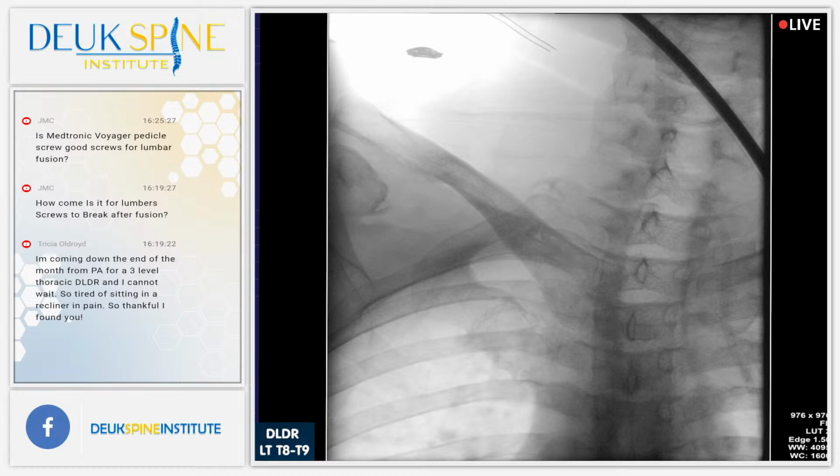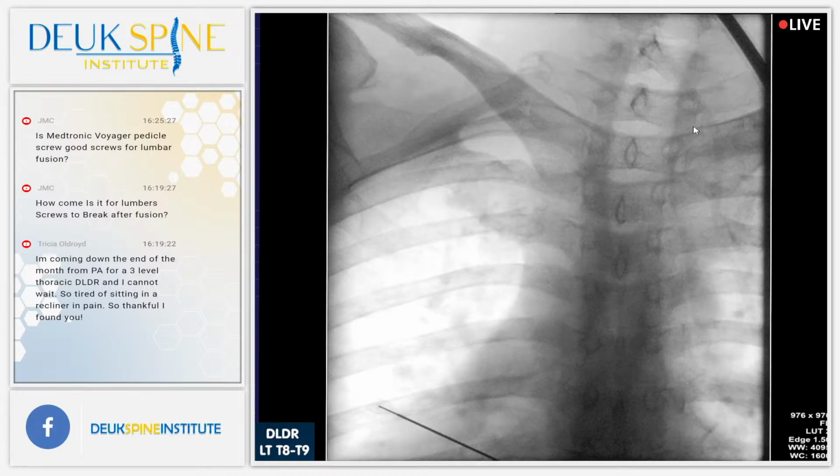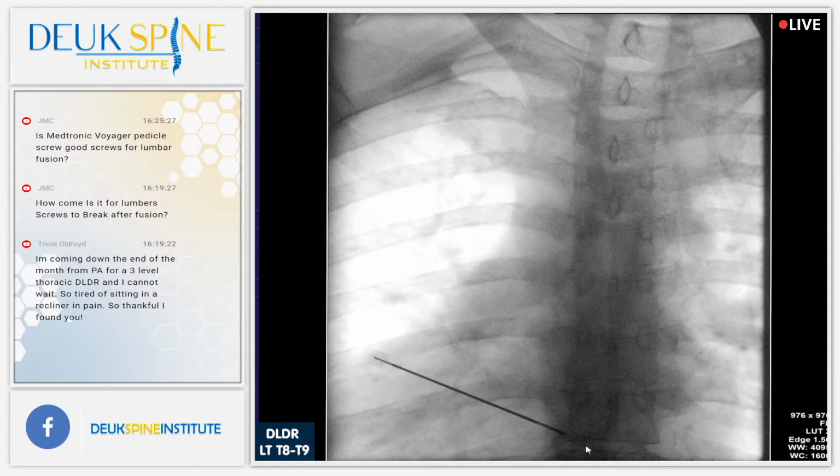Let's count. Well, yeah, so it looks like 1, 2, 3, 4, 5, 6, 7, and we kind of lose it. Let's come down just a little bit, and again, shot. All right, 1, 2, 3, 4, 5, 6, 7, 8, 9. So counting top down and bottom up, we get the same place. We're at 8-9, so we're perfect. We're exactly where we want to be.